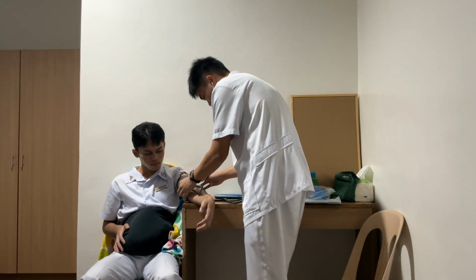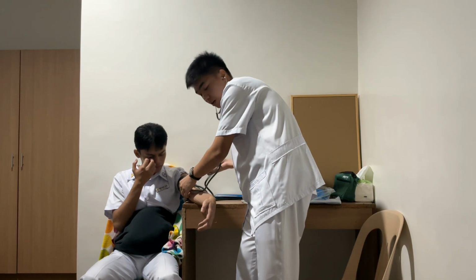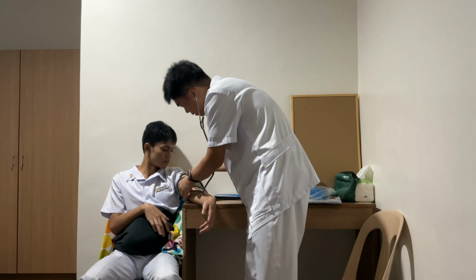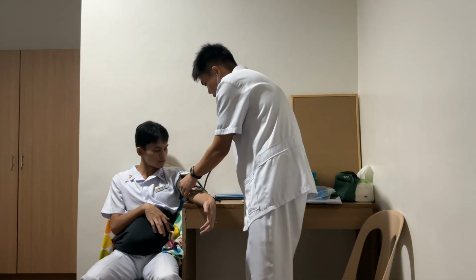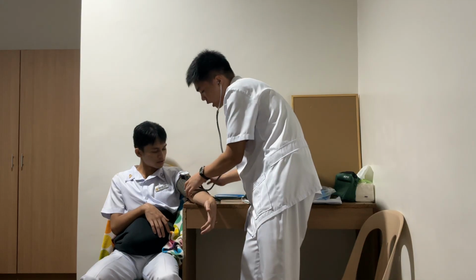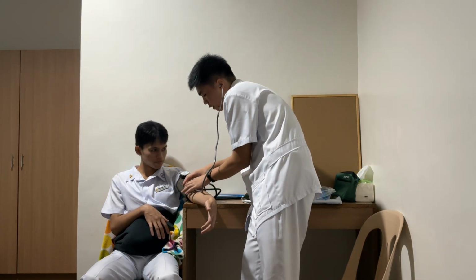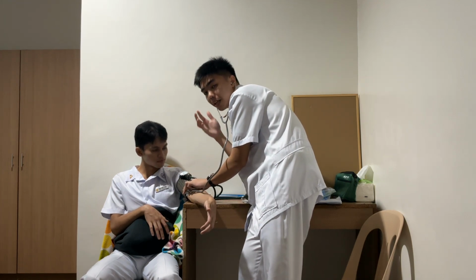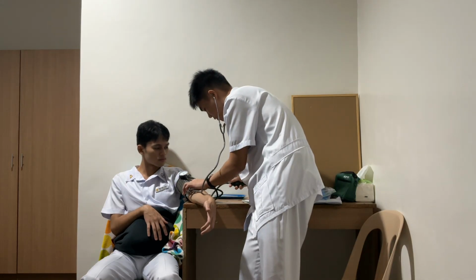Okay. So I'm just going to place it now. So while holding the bladder, I am supporting it with 2 fingers, then thumb down, to support the elbow, and then I'm going to start to listen to the sound.